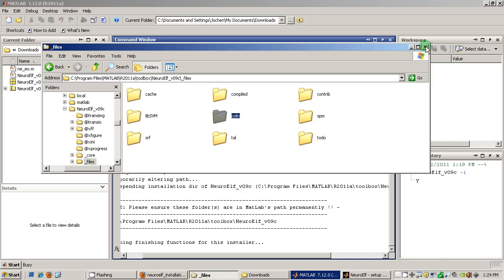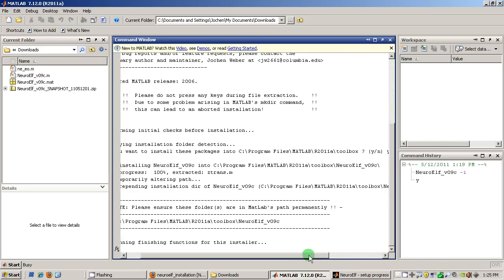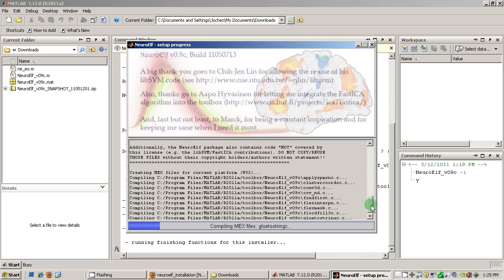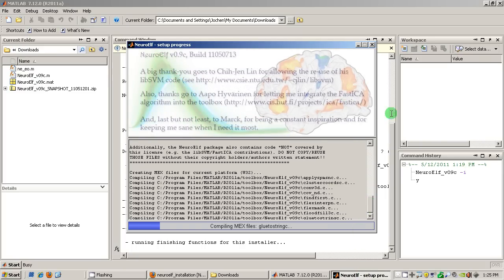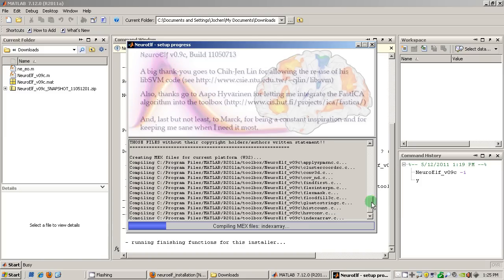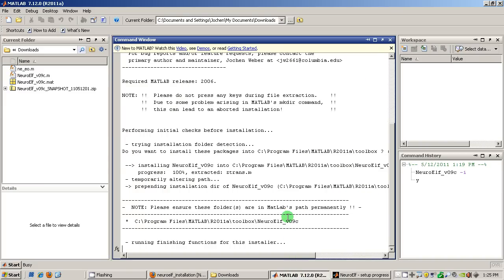And then after unpacking the files there is an additional function being called which is the setup function of NeuroElf. This compiles additional files that are very computationally intensive into mex files. They are in C code so this will take a little while. So I am switching back to MATLAB and then we just have to wait until this function is finished running.